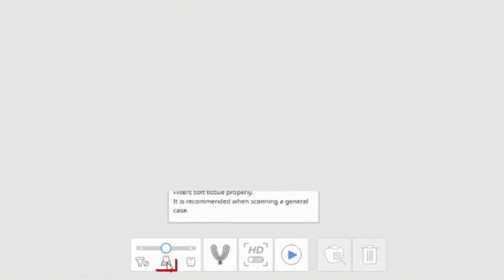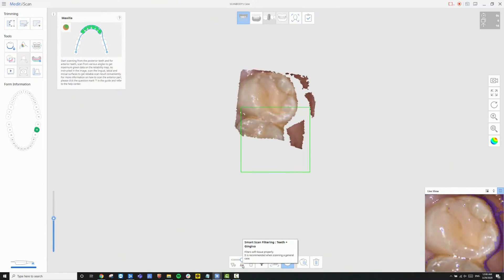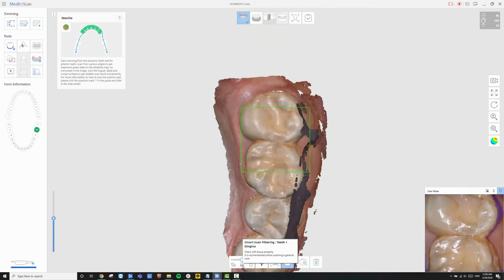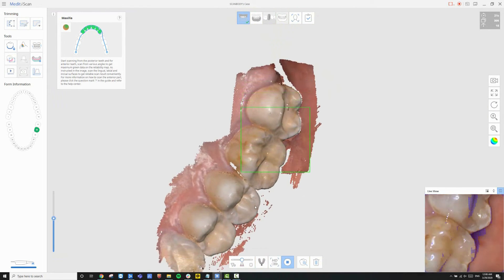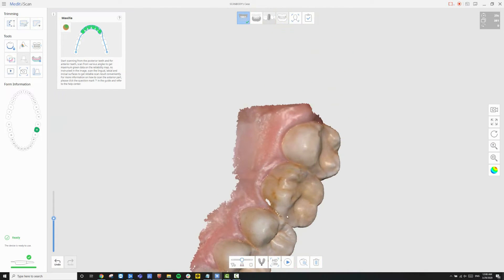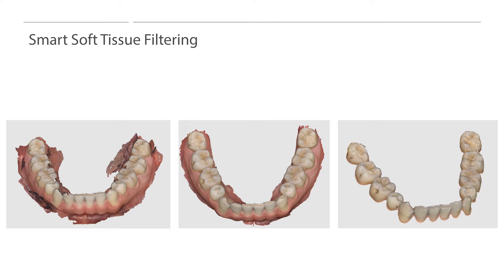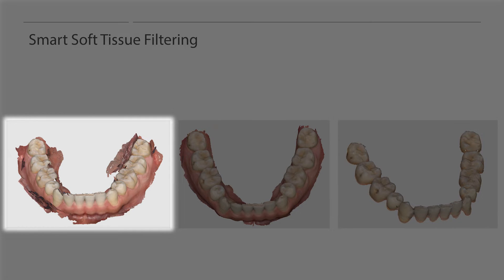Unwanted soft tissue may still get captured even with retraction. To delete any unnecessary data, users have the smart soft tissue filtering option, which can automatically filter out unwanted soft tissue. Depending on the filtering level option, the amount of captured soft tissue will vary. Here are photos of the same teeth scanned with three different filtering options. The filtering option on the left is filtering off, where the scanner will capture all soft tissue, cheek, and tongue if it crosses the scanner's field of view. Since tissue areas are not forcibly removed, this option is useful for scanning edentulous cases and typodonts.